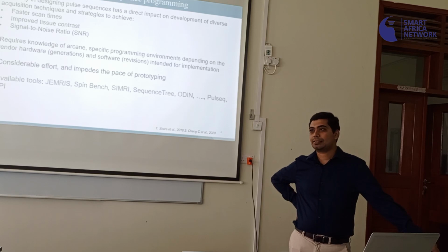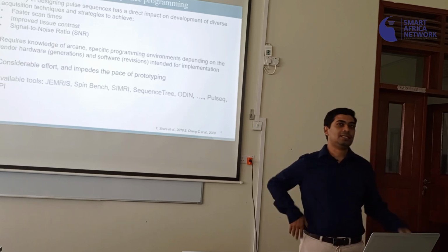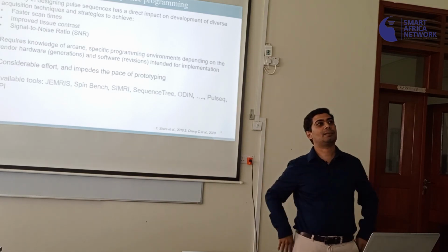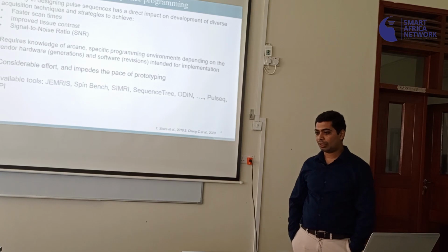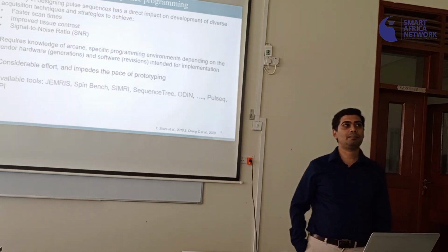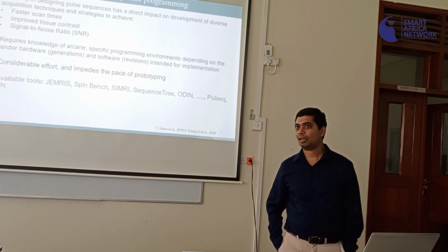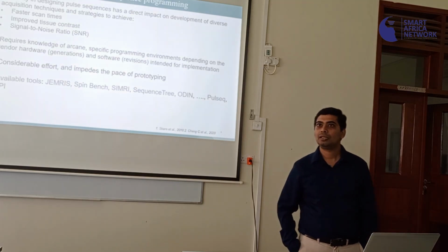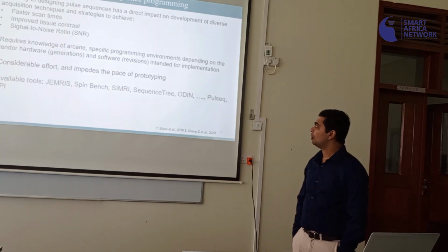If you're programming a Siemens scanner, you need to know a platform called IDEA. Just learning this tool takes about a few years before you get to do something. So the idea then is, can we make certain tools available to you, just like how machine learning tools are available in the realm of MR and pulse sequencing.